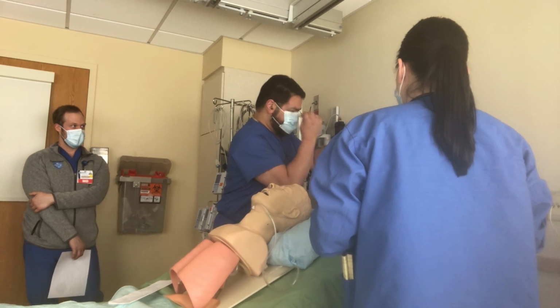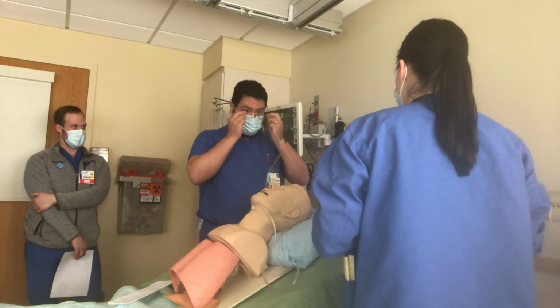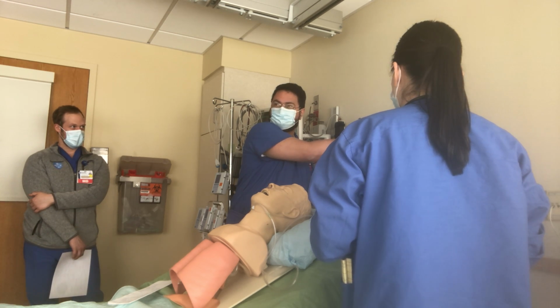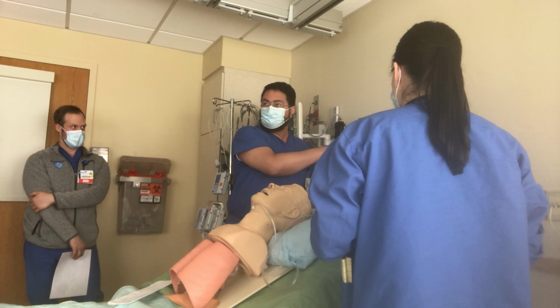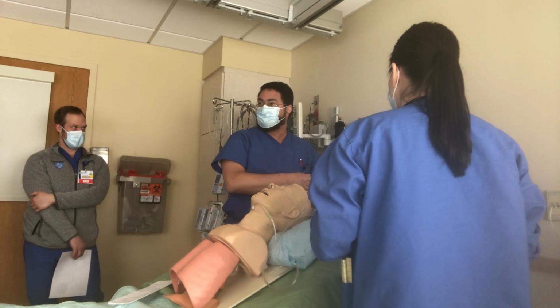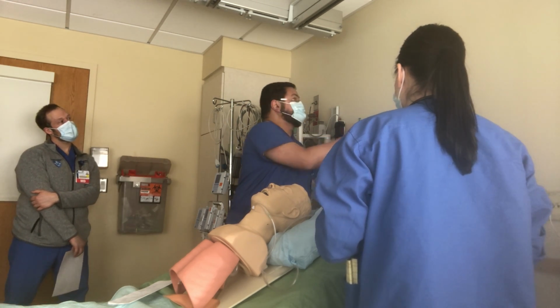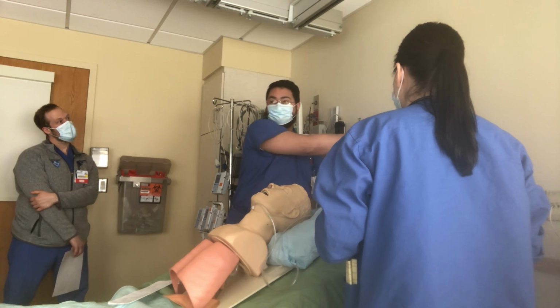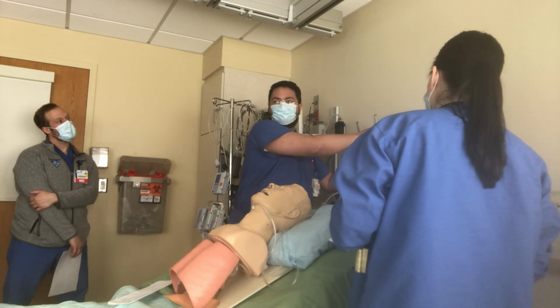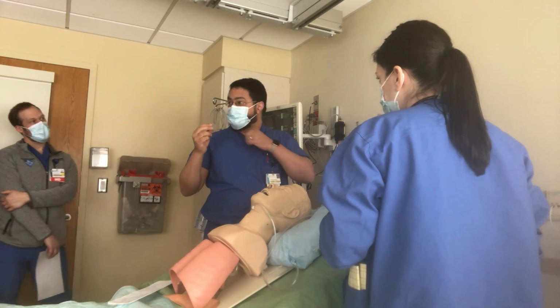Above that, if you really squint, you'll see something that says flood, meaning 150 liters per minute. Listen to the sound. Every flow meter that we have can give 150 liters per minute. They don't write it because in order to do it, the scale would have to go all the way to the ceiling, right? So they stop at 15. After 15, they say you're on your own. We're not going to measure. Just go to 150. What will 150 do?